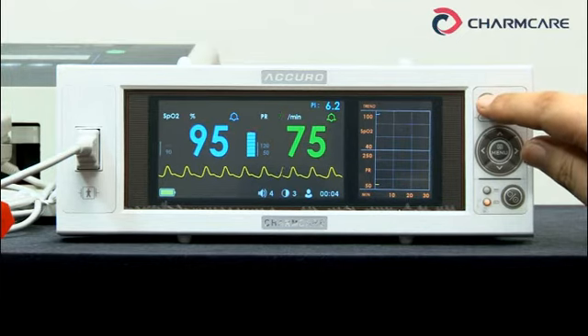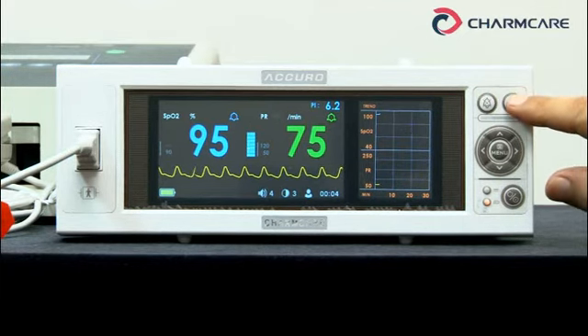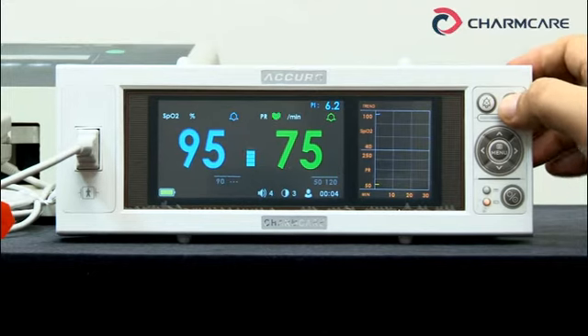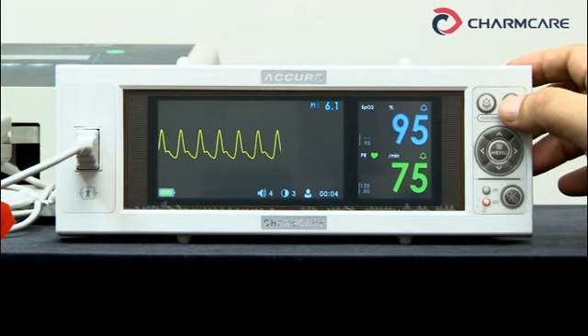This button is alarm sound pause. This button is screen mode switching — four screens are offered: first, second, third, fourth. You can indicate any screen as the main screen.